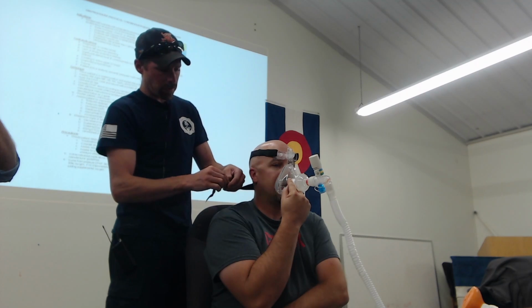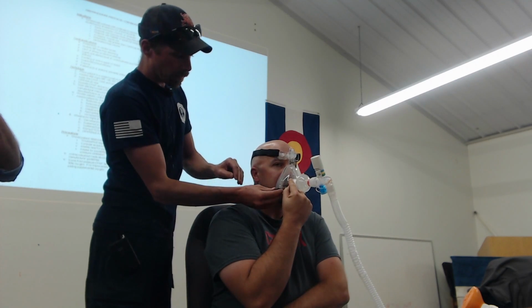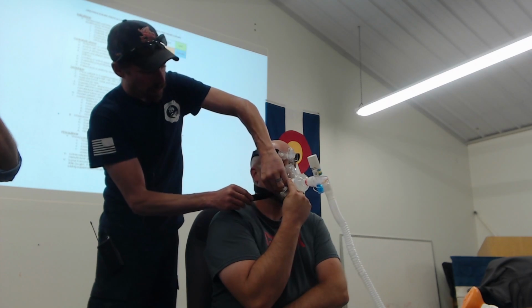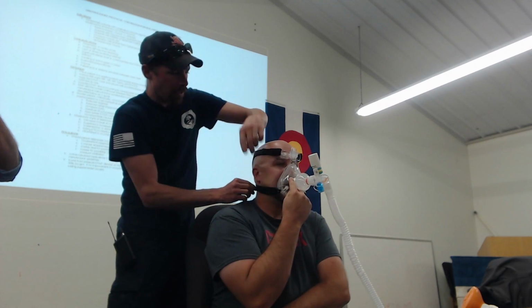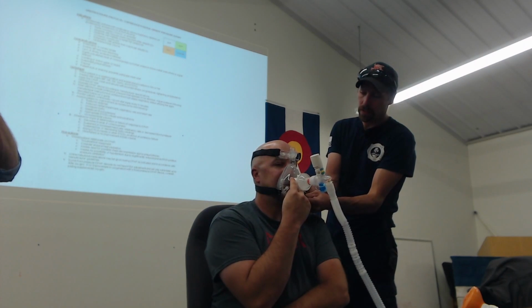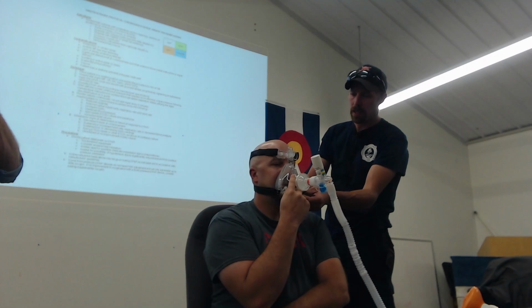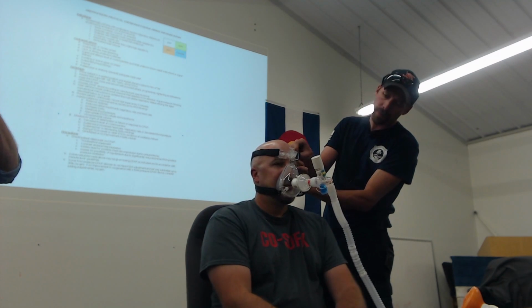And it's all Velcro, so you can move these around. I'm going to snap those on. And then we need it to be snug. We want this thing to seal, but don't get carried away. And communicate with your patient. I mean, how does that feel?